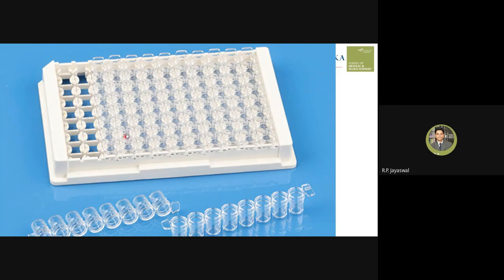This is a way we can arrange our microwells in the holders, and we can label each well as a standard, control, sample, okay, or blank.